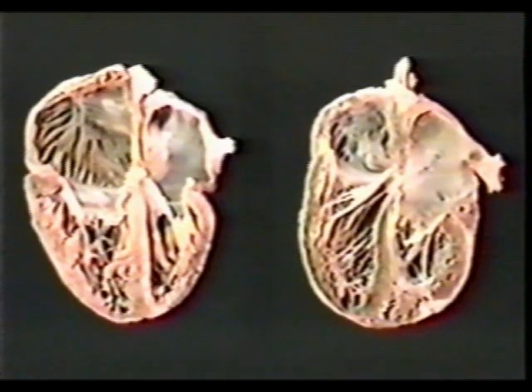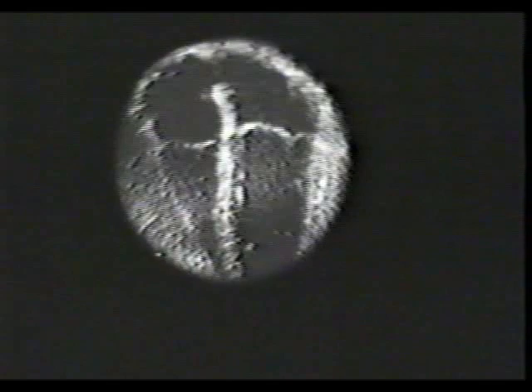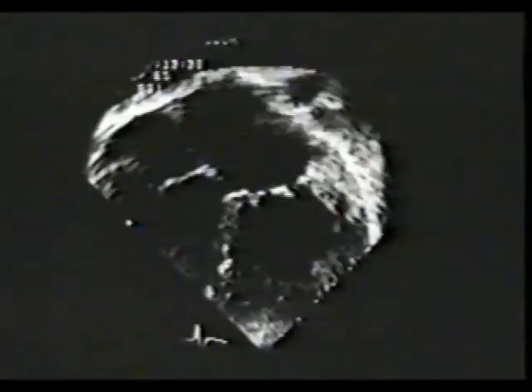Study these anatomic specimens in detail and familiarize yourself with the normal and abnormal anatomic relationships at the crux of the heart. Let us now observe normal crux anatomy in real time. This is the four-chamber view with mitral valve in this position and lower insertion of the septal tricuspid leaflet here, morphologic right ventricle and morphologic left ventricle.